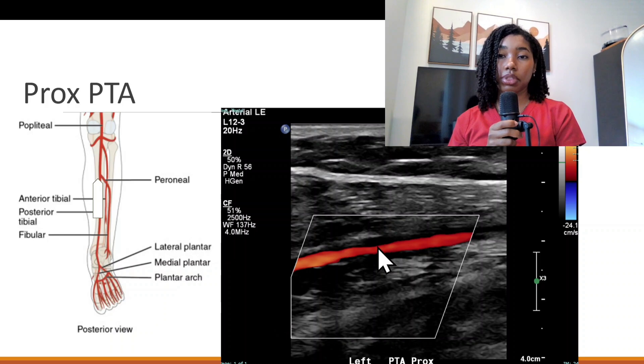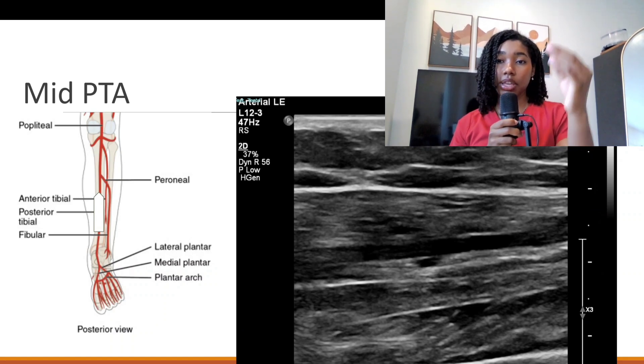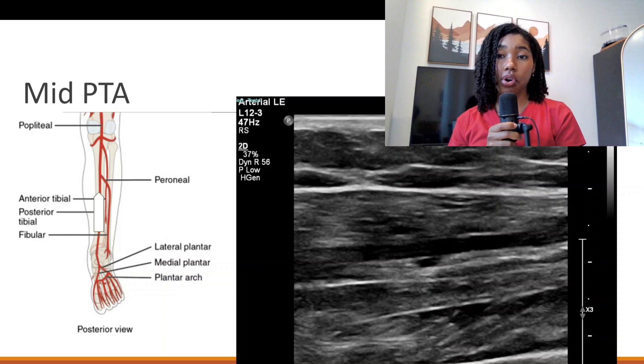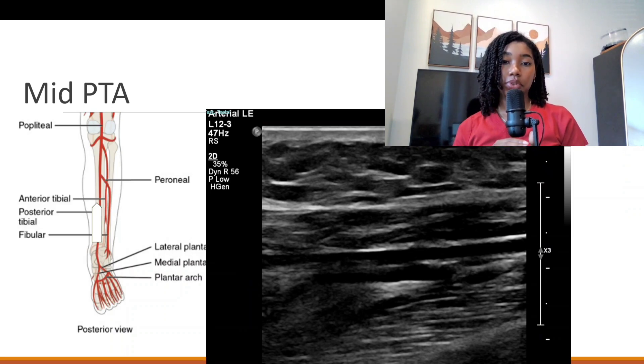With color Doppler confirmed and then pulse wave Doppler, rinse and repeat. Move slightly distally for the mid posterior tibial artery, and then more distally for the distal posterior tibial artery.